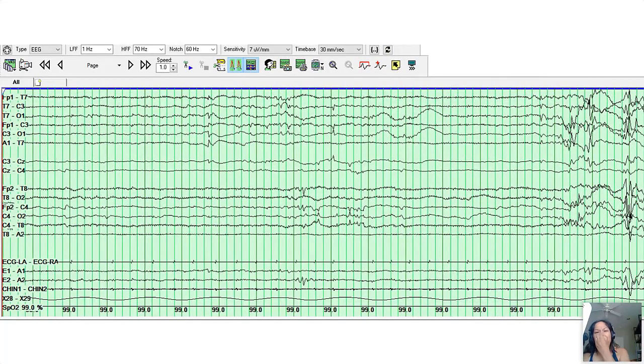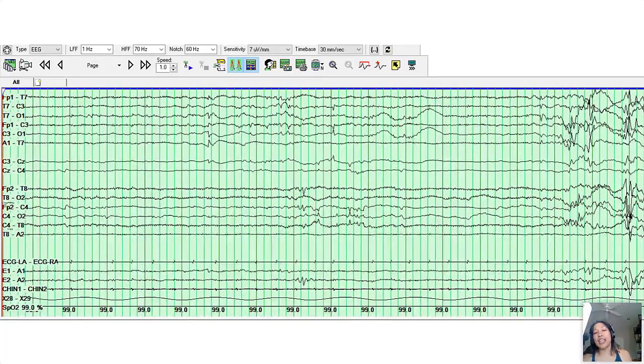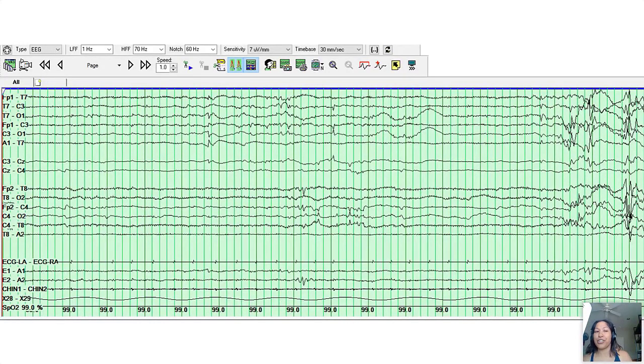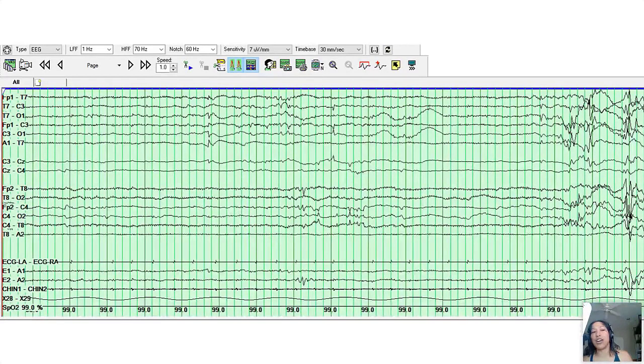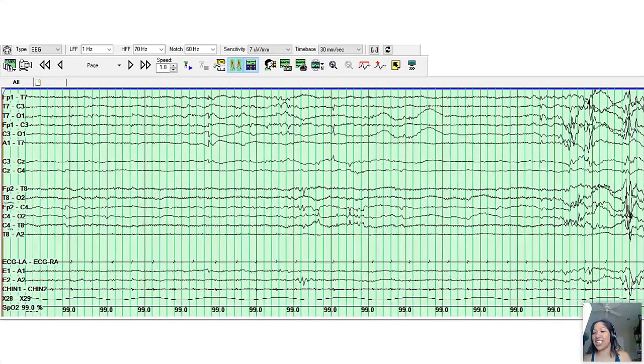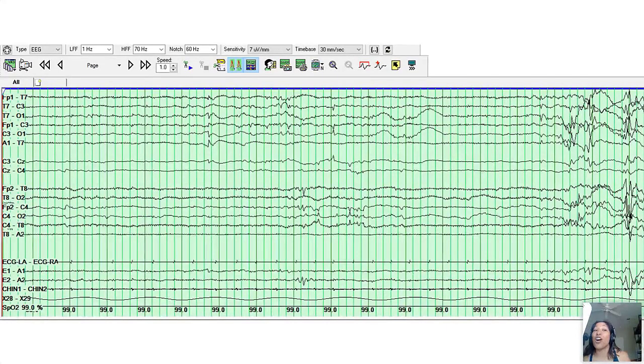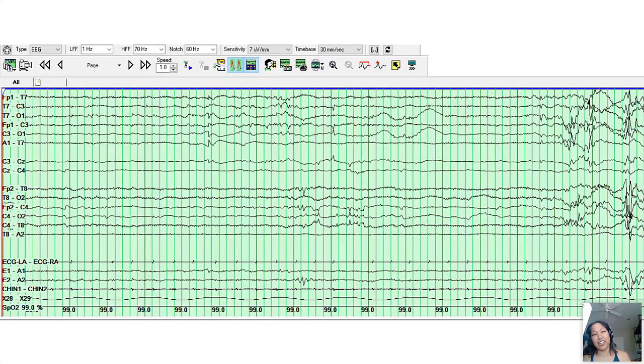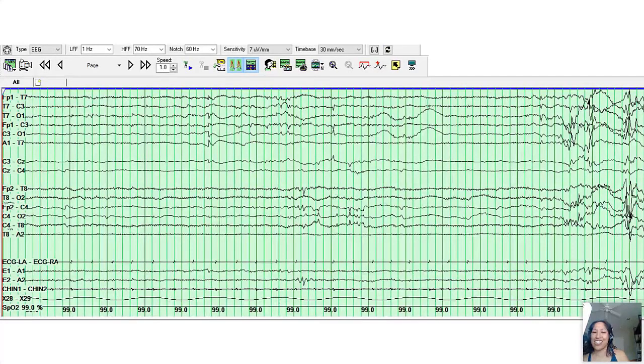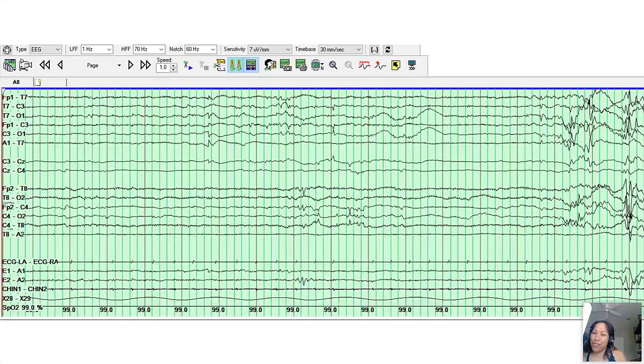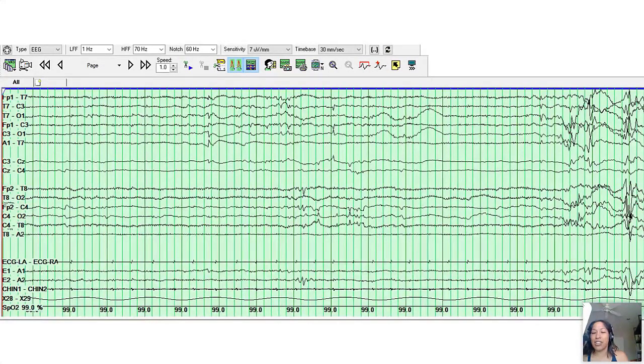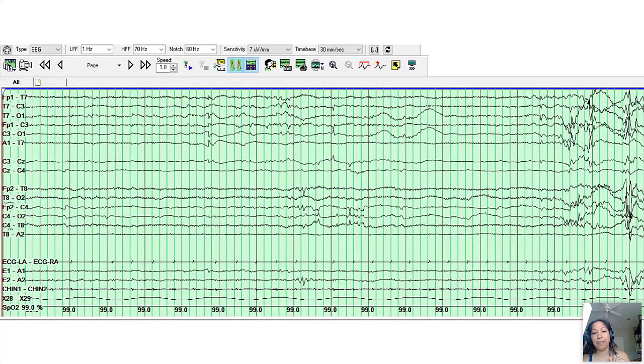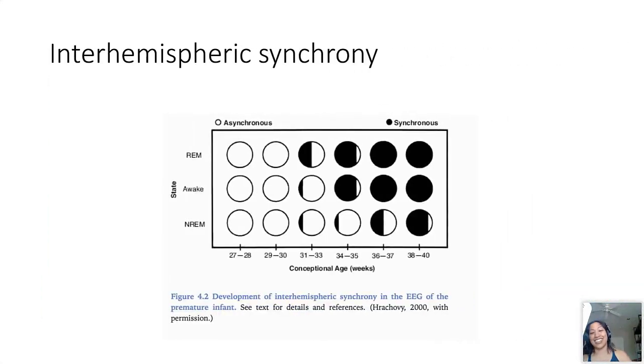Next I wanted to show an example of what just a very subtle asymmetry would look like between the two hemispheres. So at the top we have our odd numbers, the left hemispheric EEG leads, and at the bottom of the screen we have our even numbers, the right hemispheric EEG leads. And we kind of, I don't know if you can see my arrow, but essentially with this burst kind of in the middle of the page, it kind of starts in the left hemisphere before, maybe two or three seconds before, you see that similar admixture of frequencies in the right hemisphere. So that's a little bit of asynchrony.